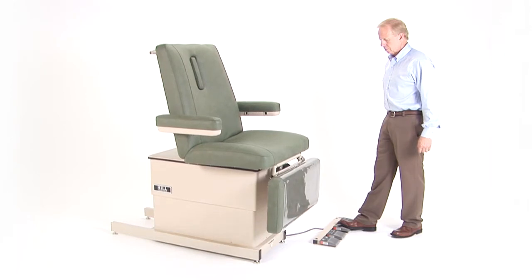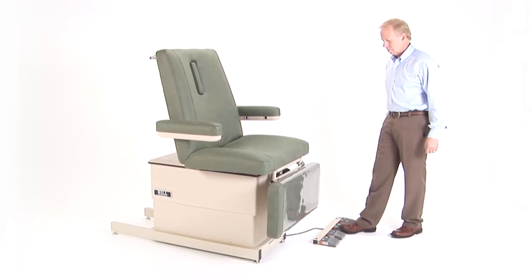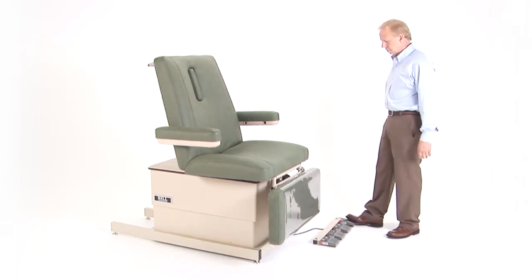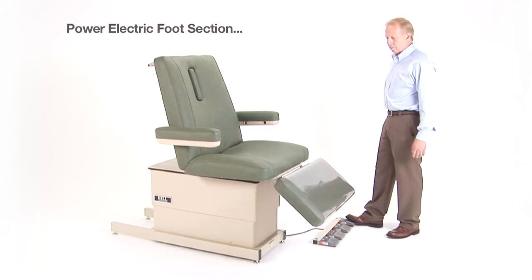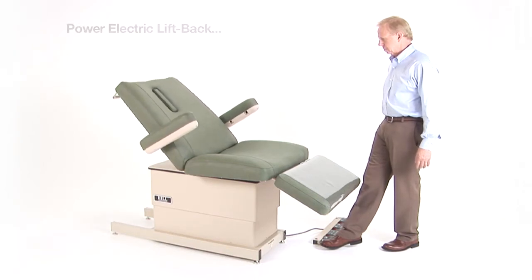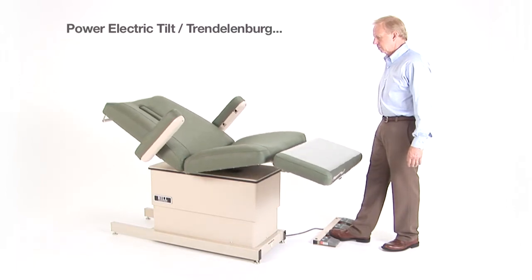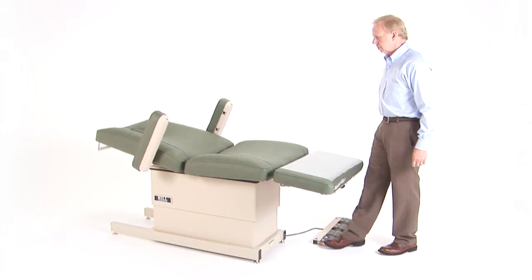The 90W is also equipped with three other electric motor functions, all controlled by the foot pedals. The electric foot section adjusts from horizontal to nearly a full vertical and any angle in between. The electric liftback effortlessly lowers the back section of the chair from a seated to a reclined position. Electric-powered Trendelenburg is used for tilting positions. Each of these positioning functions can be used together or separately.